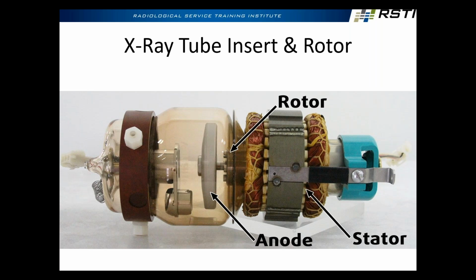Because it was a high-speed tube. So that anode, either the shaft broke or whatever happened, but that anode came off of the shaft going 10,000 RPM. So you've got about 3.5, 4 pounds of tungsten going 10,000 RPM. That's a lot of energy. When it comes off of that shaft, that housing is not going to stop it. It flew through the side of that housing so fast that the housing just went like that. It cracked, and then it bent enough to let the anode out and then sealed itself back up. That's why he only had a little bit of oil on the table, right?